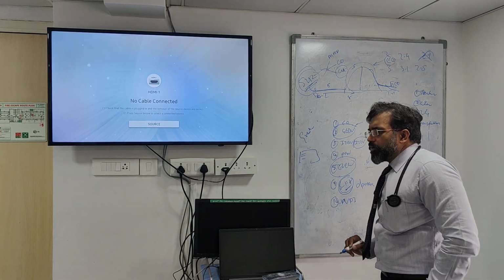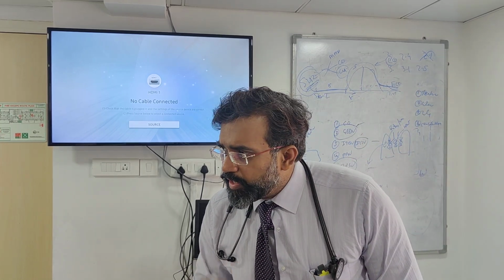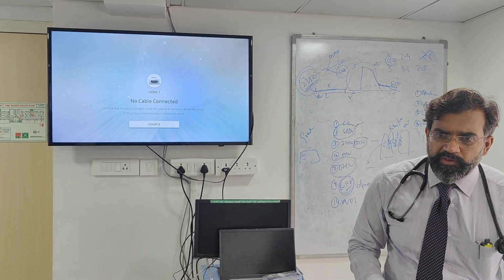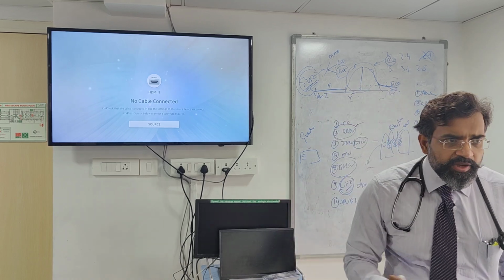Another thing that you can look at is PVPI, pulmonary vascular permeability index. Is it there on that? See? Yes, PVPI. So PVPI is pulmonary vascular permeability index. Okay. Now what does the PVPI tell you?